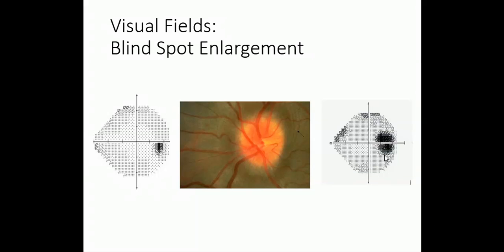Now, for those who are more informed about what's going on here, there's debate about whether that's really the mechanism of the blind spot, and it might have to do with other optical issues, but this is at least just a good way of conceptualizing what's going on.